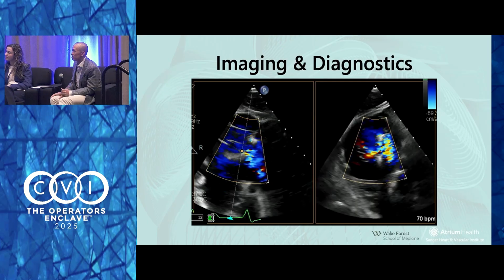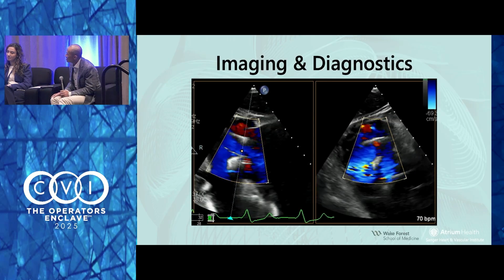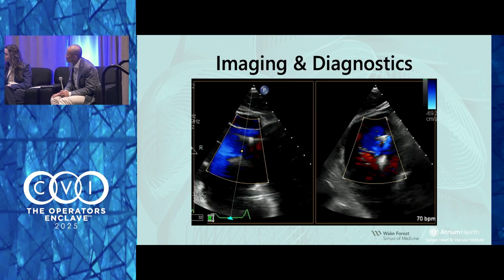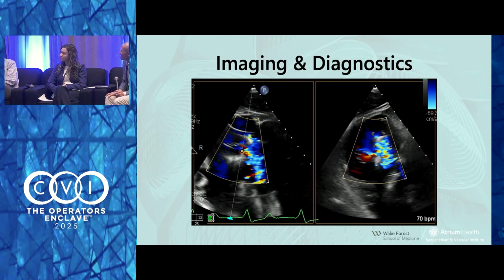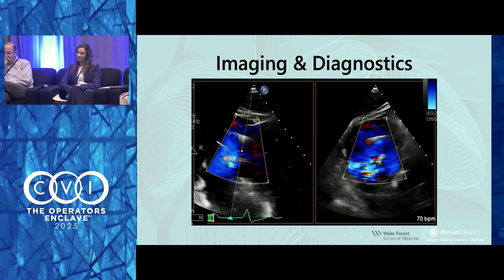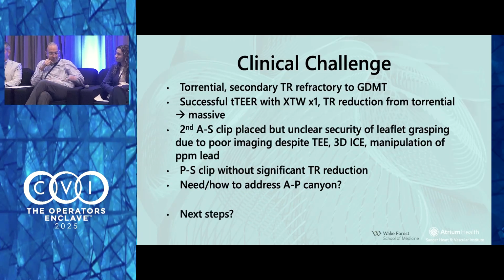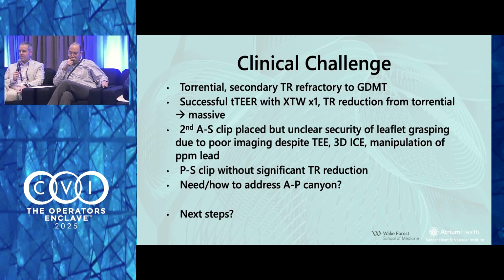Tricuspid valve. I would see this as a heavyweight fight, and you have about 5 more rounds of pummeling to go. I'd probably ask for a break and do some medicines, and come back and allow for potentially a little remodeling, and then do ICE again. I think there is probably a septal landing zone there.